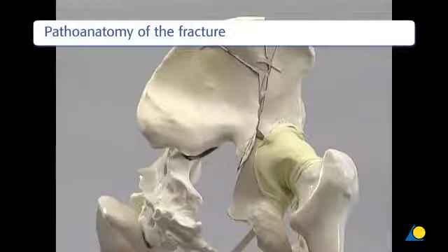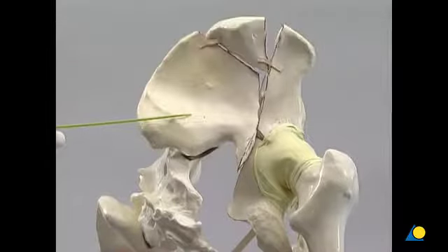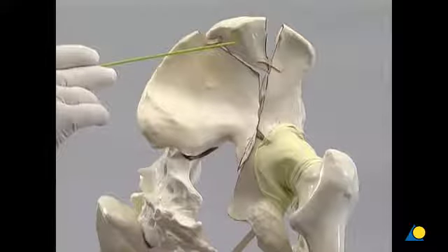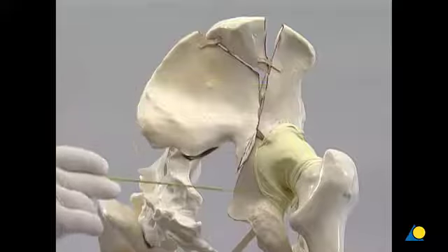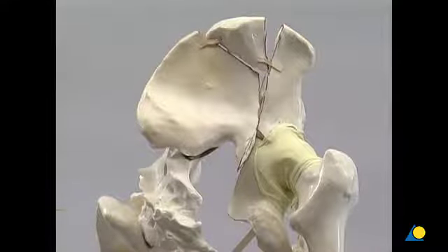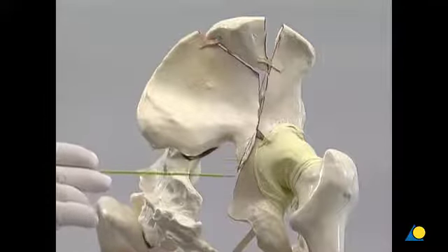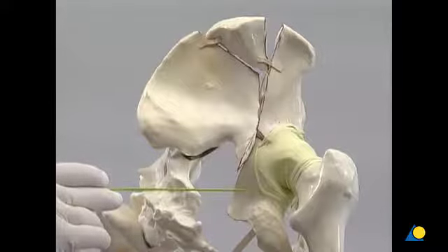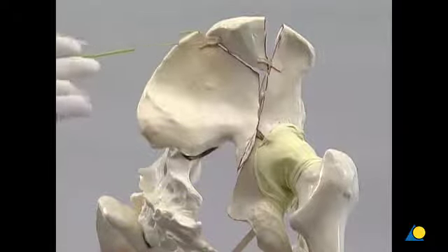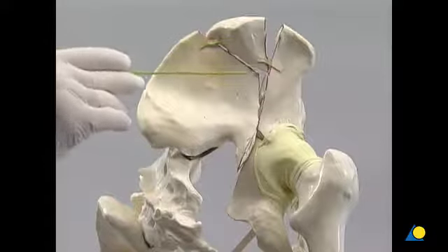The plastic model shows that a part of the iliac wing is still attached to the sacrum. There is also a large free fragment of the iliac wing. The anterior column fragment is connected to the articular surface, as is the posterior column. The main fracture line through the iliac wing is oblique and runs from lateral to medial. The greater sciatic notch is fractured. The distal fragment is displaced medially. There is no continuity between the dome and the sacroiliac joint.